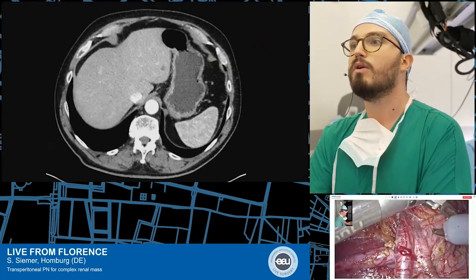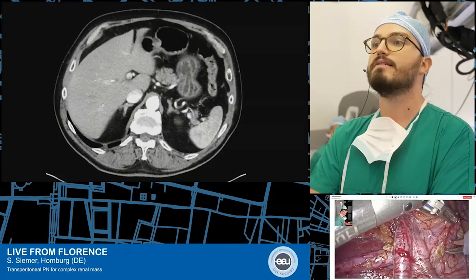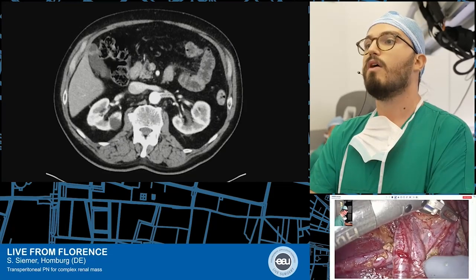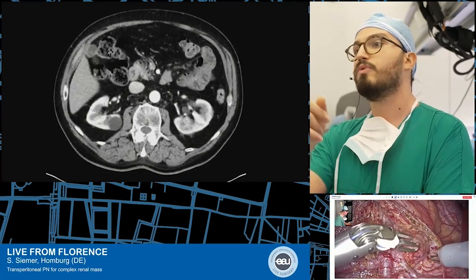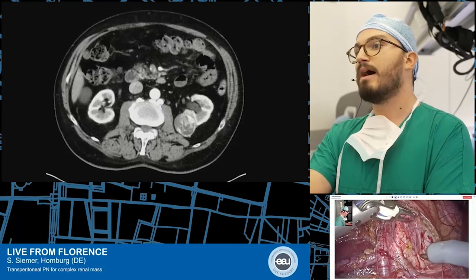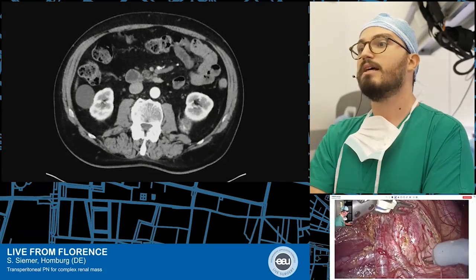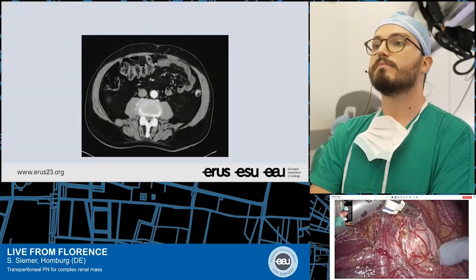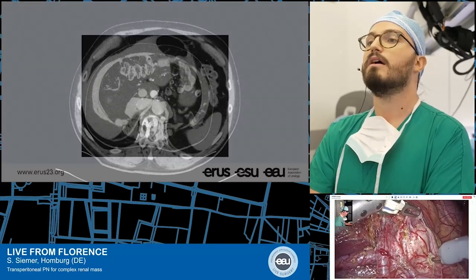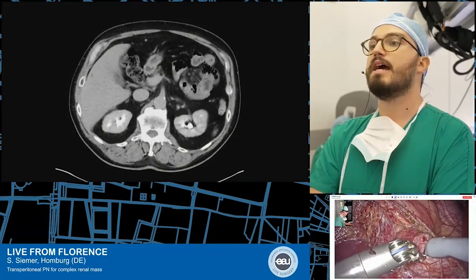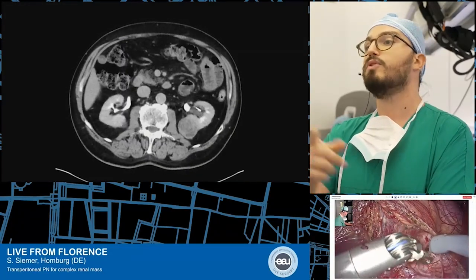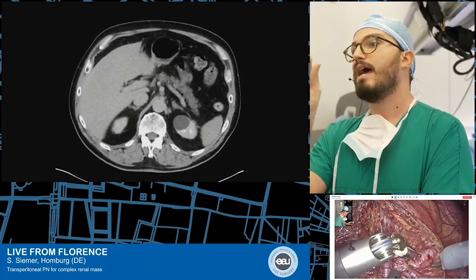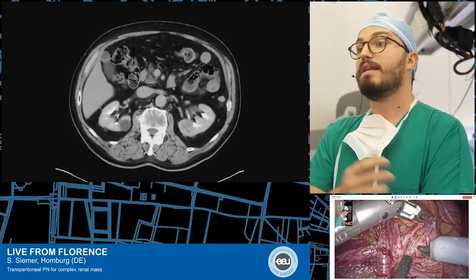The arterial phase gives us the opportunity to see the vascular aspects of the left kidney — the two arteries, the left renal mass located posteriorly, medially, and mesorenally — and the vascular system. The urographic phase shows the relationship between the left renal mass and the collector system.